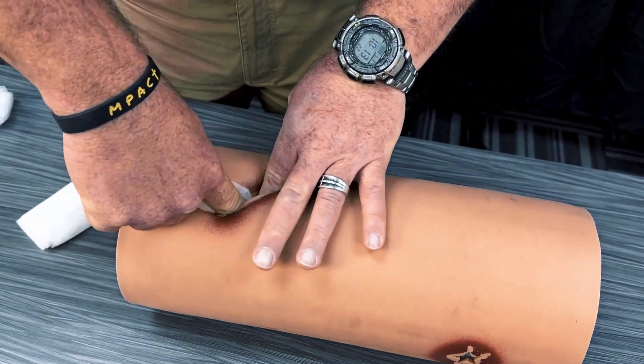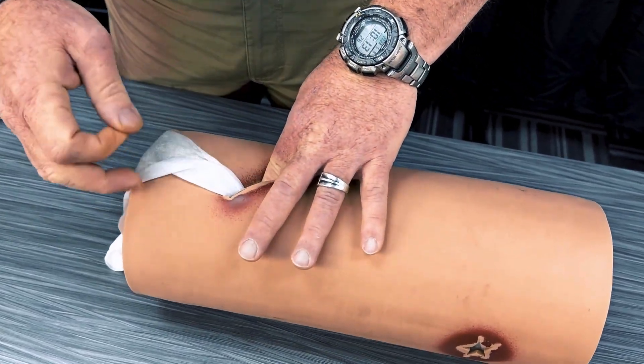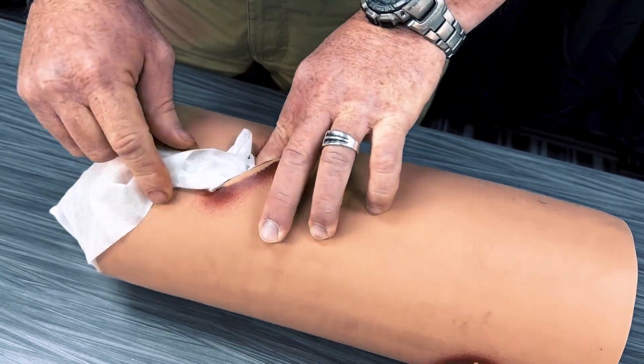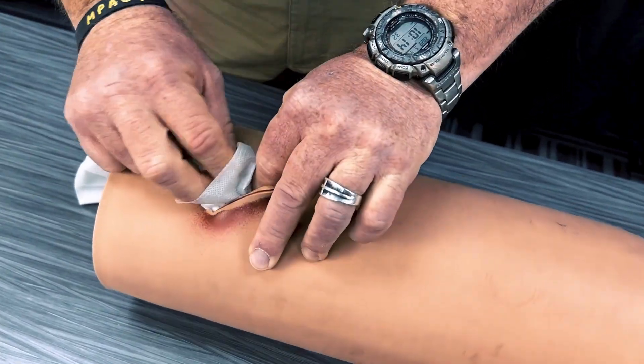Apply constant pressure with one hand. With your other hand, grab a length of gauze of about two to three inches. The gauze should be placed underneath the hand holding pressure. Next, using the same hand to grab the gauze earlier, grab another length of gauze and repeat. Continue until the cavity is filled with gauze.